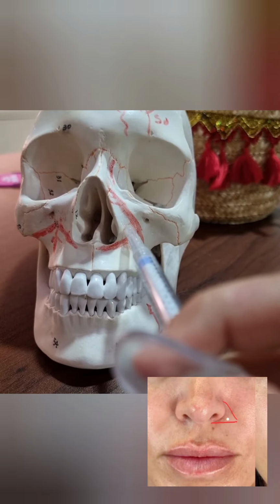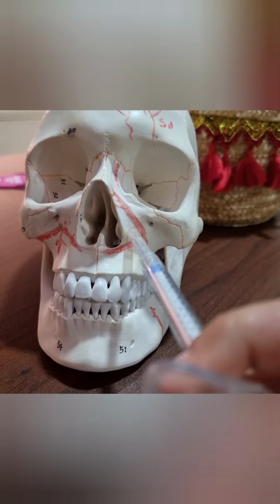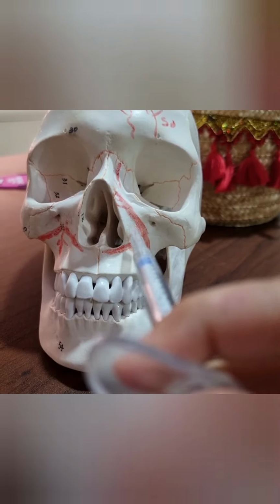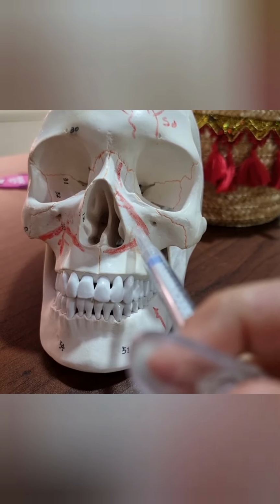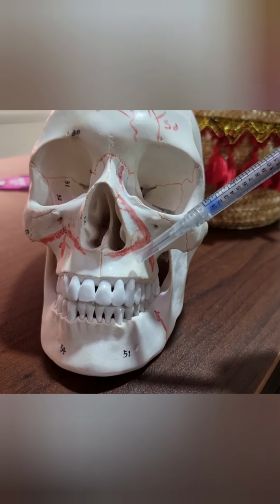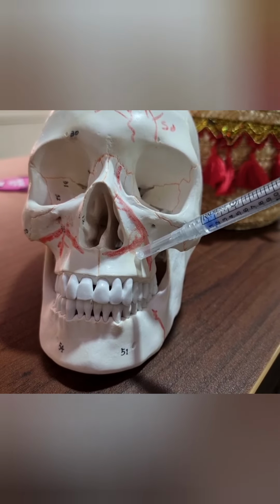طيب هنعرفها إزاي؟ هشاور لكم على صورة تانية. I will mark another picture to show that we must be exactly in the alar triangle. I take a line from the ala of the nose, I take a line from the alar groove and make a triangle. I inject in this triangle. Your needle must be directed to the oral commissure like that or like that.